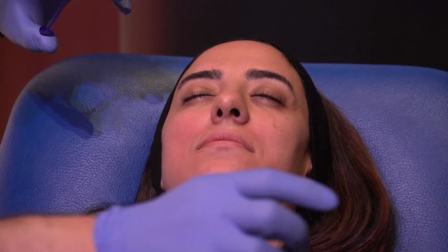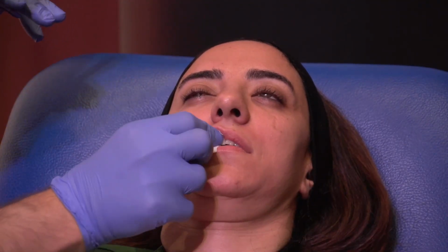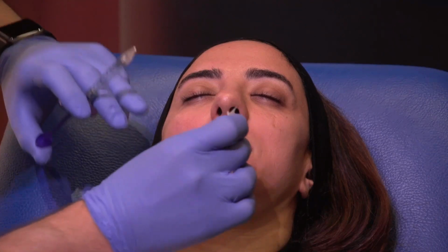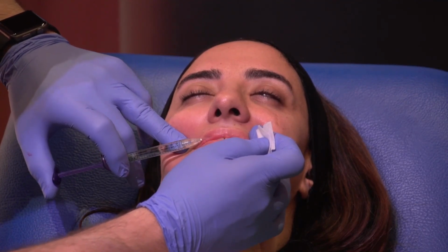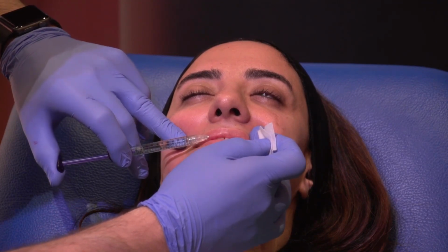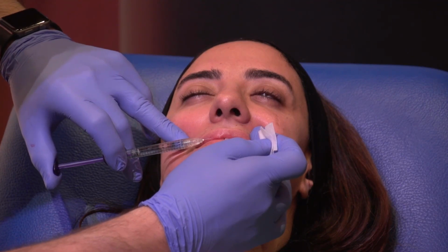Okay, alcohol swab. That's what I said about alcohol swab. It's always next to me. I'm always wiping the lip. Is it too painful? It's okay? Oh, perfect. Okay, so you can see that augmentation already starting to appear. Minimal product, I've just used 0.1. Okay, again, I go at the end of my needle where I've injected, go all the way medial. They start having a little bit of sensation more medially, and I'm injecting as I'm pulling out.